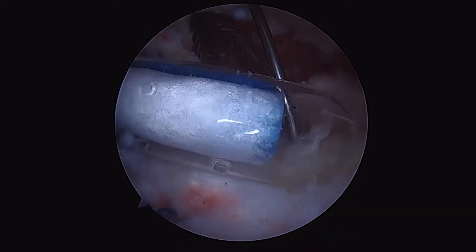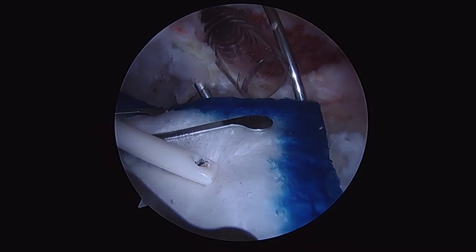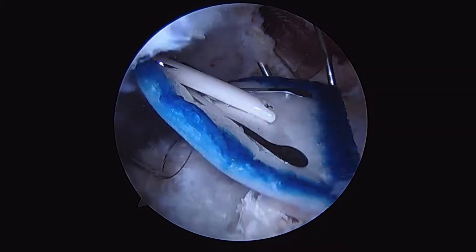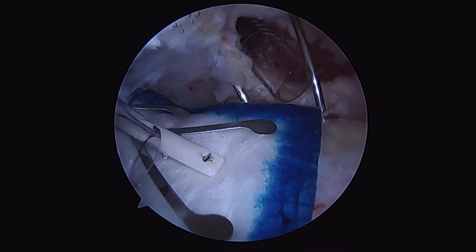You can see I've got my suture anchor in place. In this case, we're going directly on top of our supraspinatus first. Those are our biceps tendon markers in the background. We've got good position for our tissue deficiency, but you can see we're not going to be able to cover the lesion in its entirety, so it's going to require a second implant.